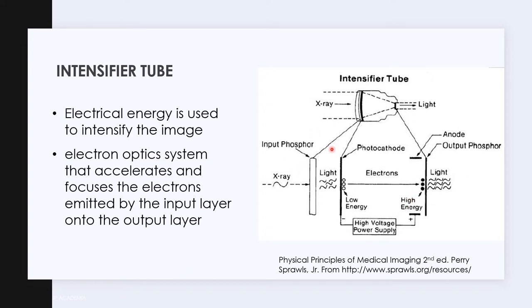The figure here shows the events that produce electronic gain in an image intensifier tube. So, the image intensifier tube body is just an evacuated bottle where the large area, which refers to this one, the bottom of the bottle, is the input screen, and the small area shown here, or the cap on the bottle, is the output screen.